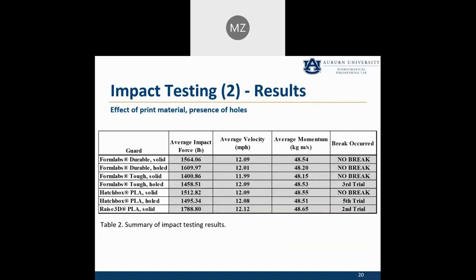So here's the results. You can see the Form Labs Durable material, both the solid and the holed version, withstood impact and did not break. The Form Labs Tough version also did not break. Interestingly, the Form Labs SLA tough resin holed version did break. It broke in the third trial.